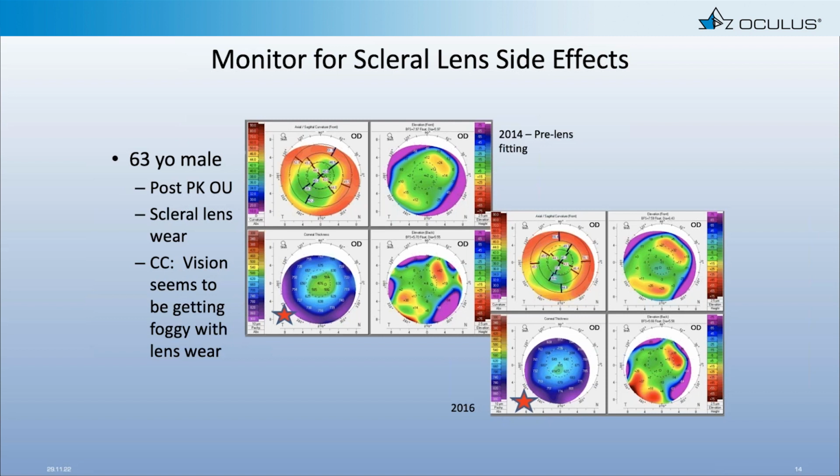Finally, from the anterior segment disease monitoring aspect of things, for our contact lens specialists, we're probably fitting a lot of corneas that have potential for complications as it relates to scleral lenses. Our graft patients in particular, a lot of times we have to worry about corneal edema, especially as we have aging grafts or high prescriptions in our lenses, et cetera.